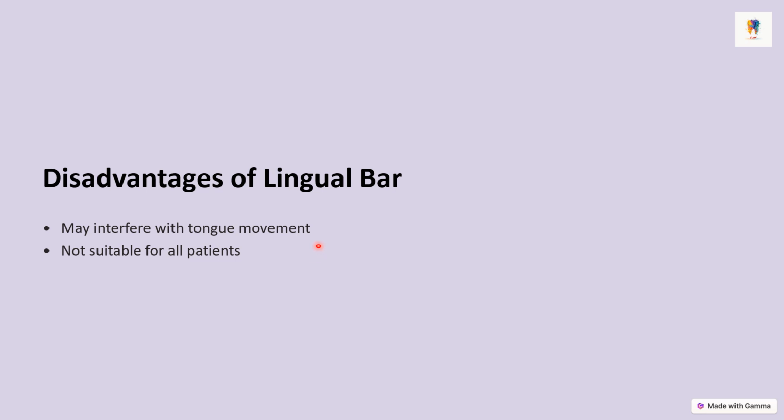It also may not be suitable for all patients. Every patient has their own anatomy, so there may be a condition in which you cannot give the lingual bar to the patient. You have to go to other options. So this was all about your lingual bar.